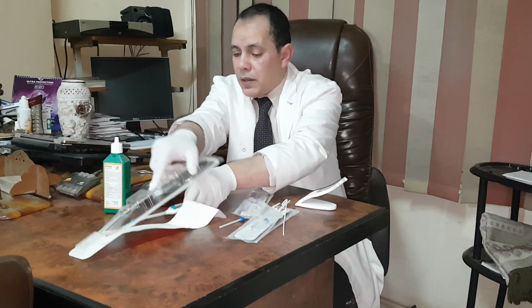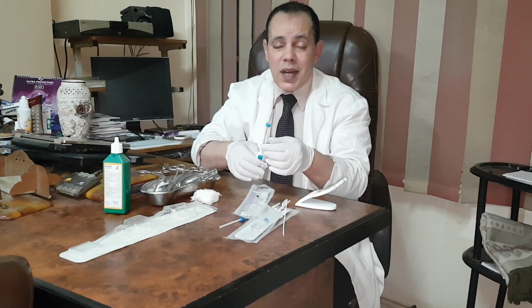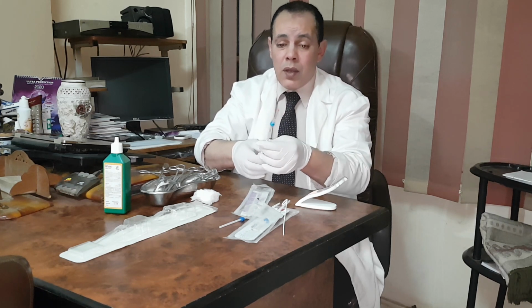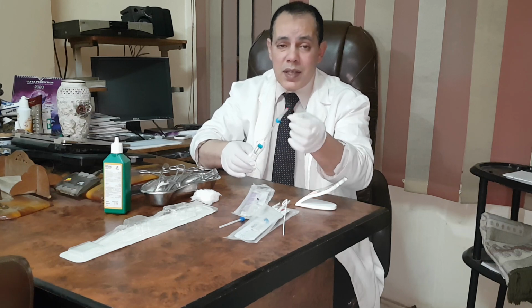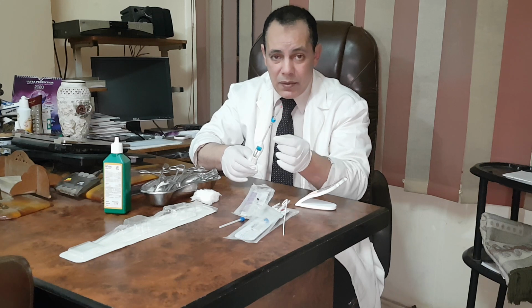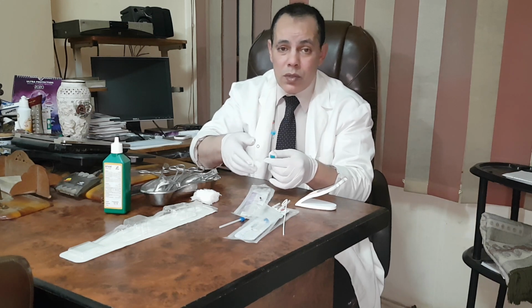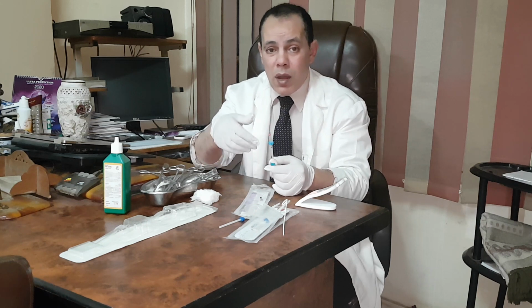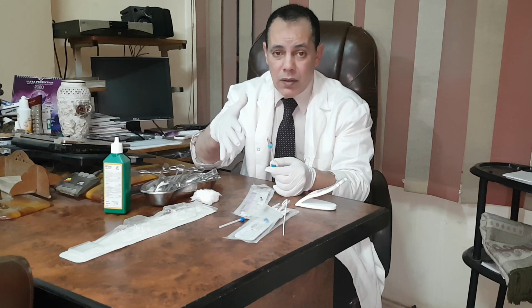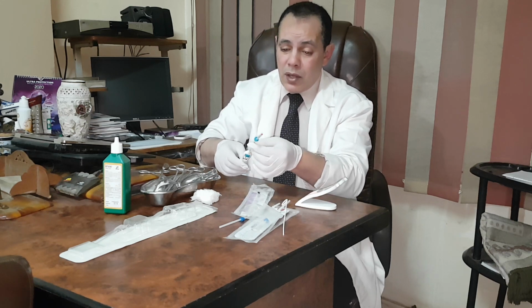The third one is called the intrauterine device releasing hormone, called Mirena in the market. This one releases a low dose of levonorgestrel every day inside the uterine cavity. It is used as a contraceptive method and also as a medical treatment for abnormal uterine bleeding from different causes.